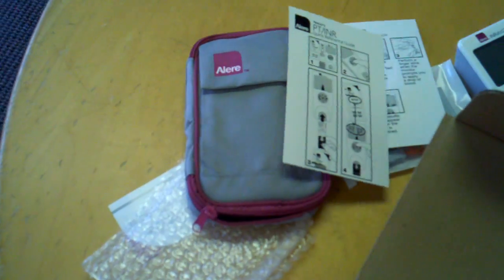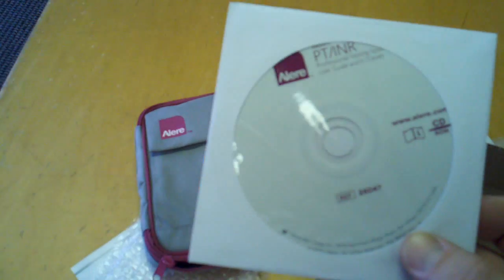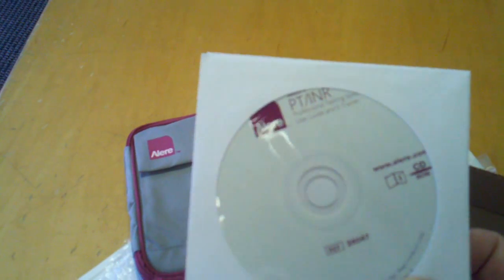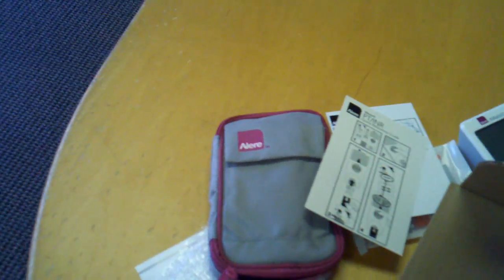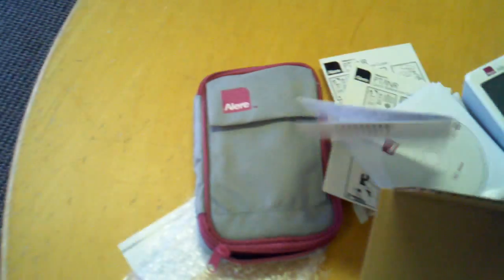The instructions are included. What's really nice is this CD or DVD — we call it the e-trainer for your CD-ROM — that comes with it also. And then you have the warranty information, which we do manage 24/7. It also includes the user guide.